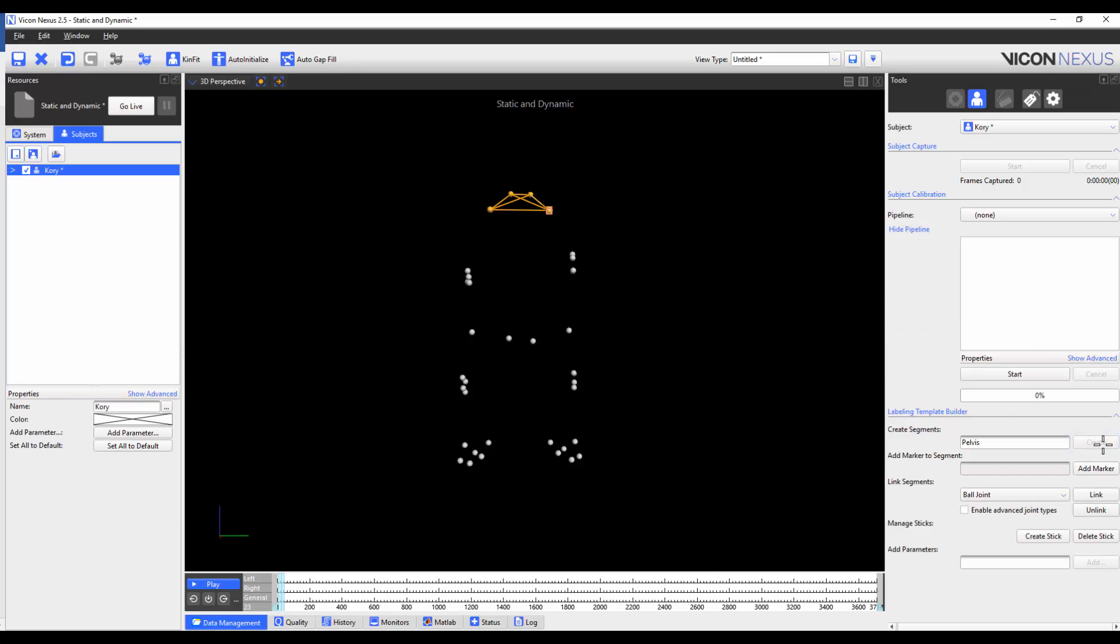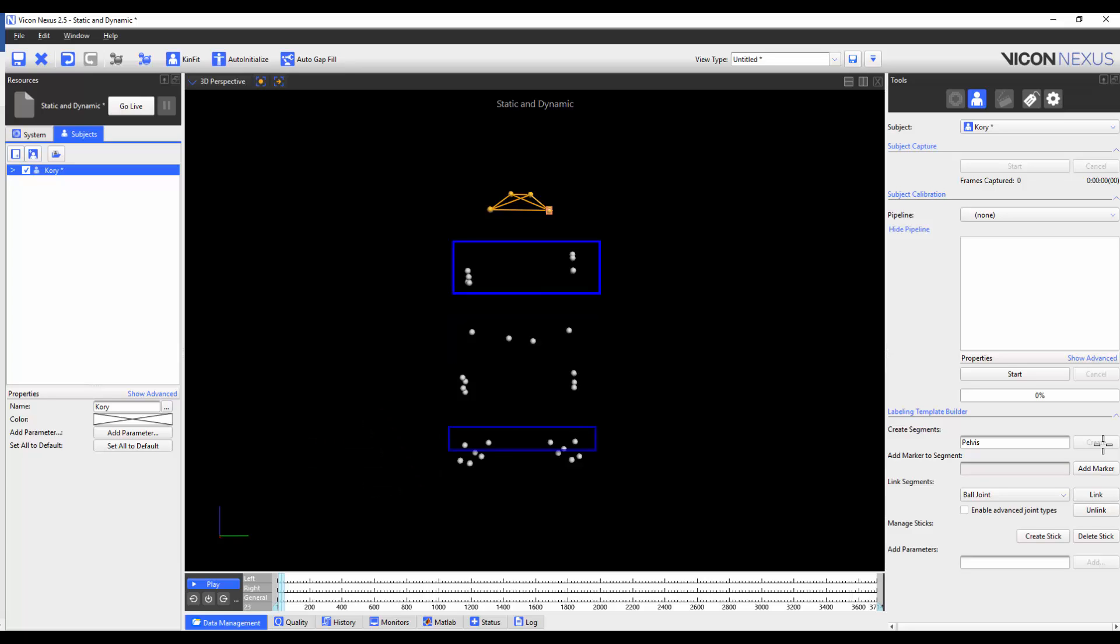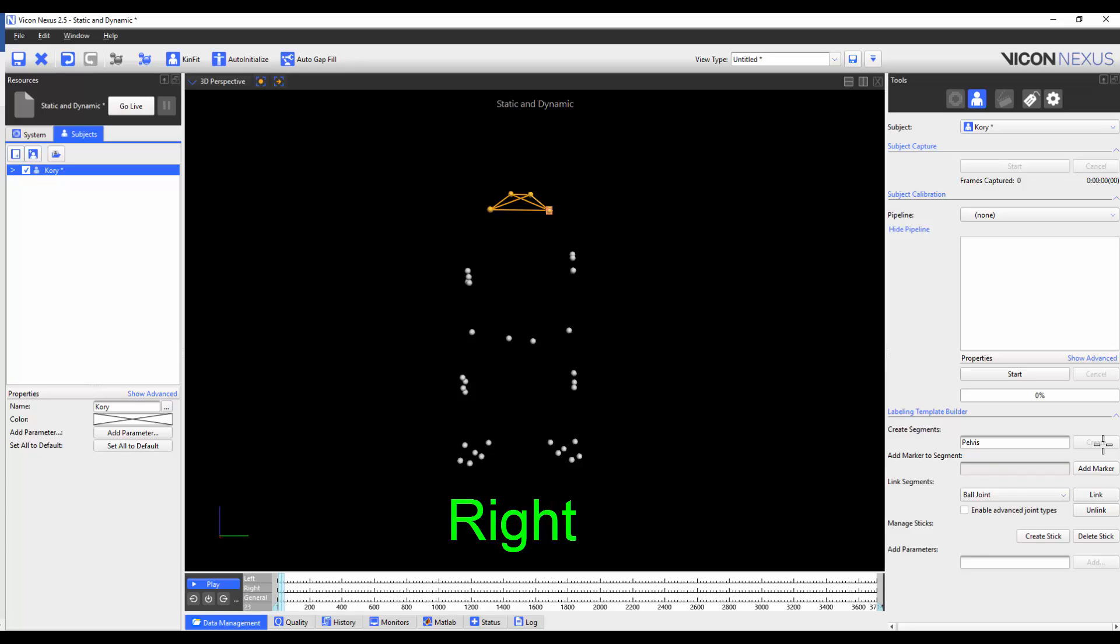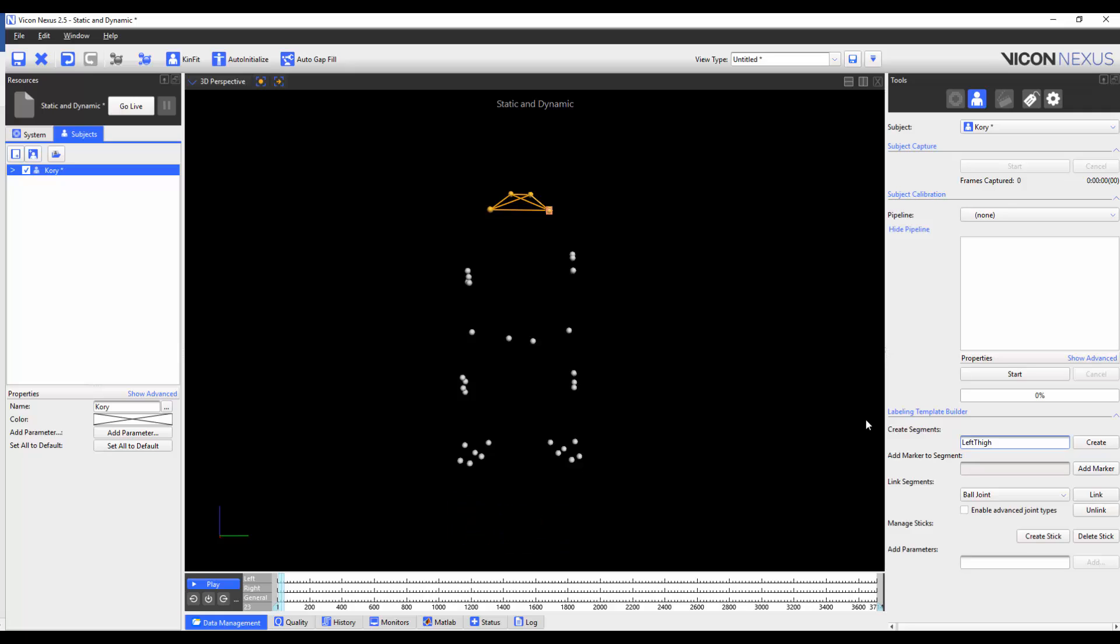I'm going to continue the process with the remaining segments, starting with the left thigh segment all the way down to the right foot. I'm also going to be placing the knee markers in the thigh segments and the ankle markers in the tibia segments. You'll also notice that when I'm typing the segment name, I'm including the word left or right as well as the segment name, all one word. For example, left thigh. Nexus 2 will automatically designate the word left with the colour red and right with the colour green.